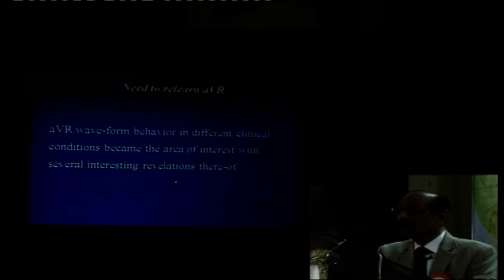Therefore, we visited AVR while searching for ECG evidence in non-STEMI Trop-I positive cases, accepting that the ST deviation in AVR needs to be addressed in its own right, particularly in the background of other evidence of acute coronary syndrome. Therefore, we relearn AVR here. AVR waveform behavior in different clinical conditions became an area of interest with several interesting revelations.